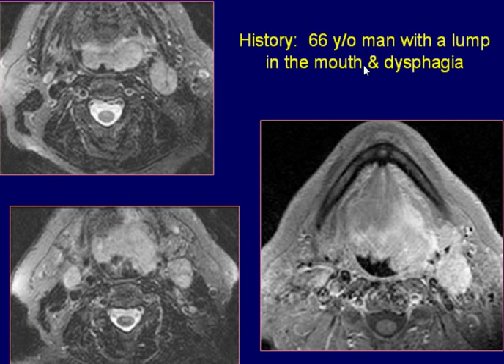A 62-year-old man with a lump in the mouth and dysphagia. Axial fat-saturated T2-weighted images demonstrate a large, irregular, hyper-intense lesion in the posterior portion of the tongue. The oropharynx is nearly obliterated by the mass lesion.